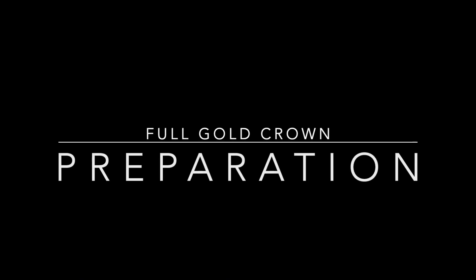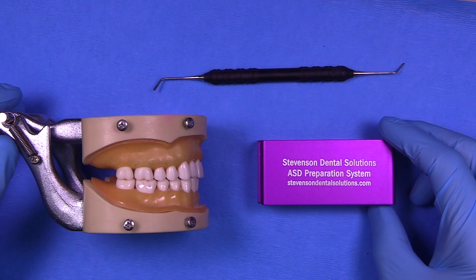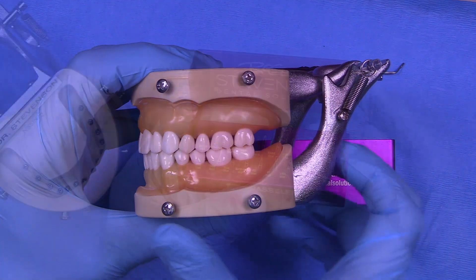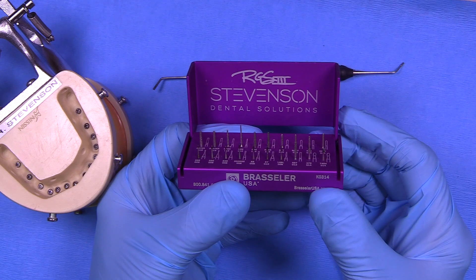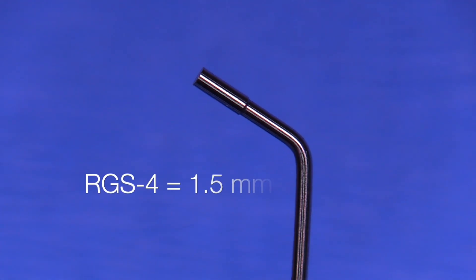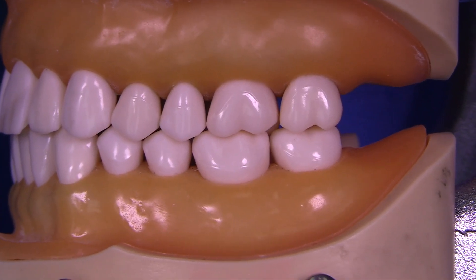Today we're going to cover the full gold crown preparation on the Kilgore typodont. This is the 28-tooth typodont that many schools use. This is the Advanced Standing Dentist Burr Kit, which I really like, and this is the RGS-3 — the opposite side of this instrument is the RGS-4. These are all critical tools to complete this project.